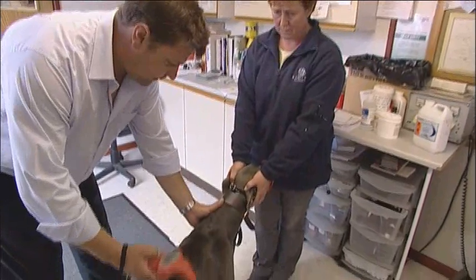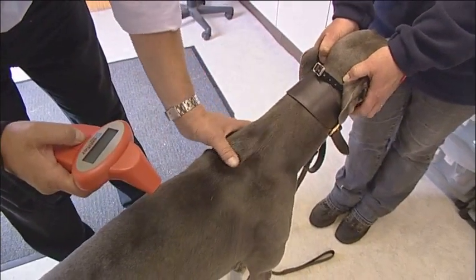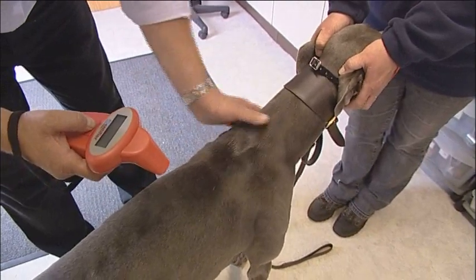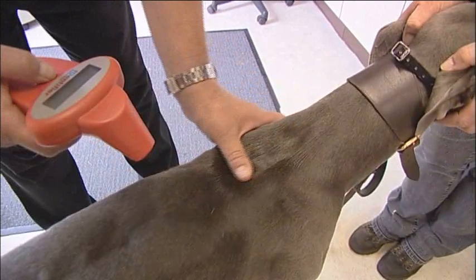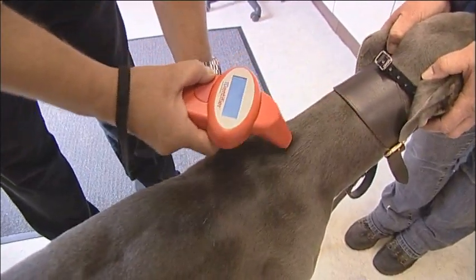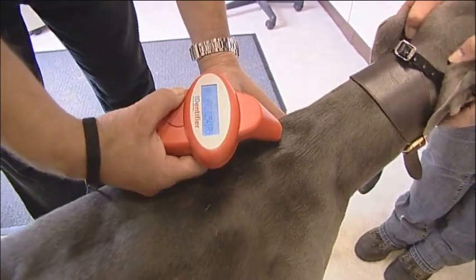To ensure that the microchip has been inserted correctly, firstly we just run our thumb over the implantation site and make sure we can't actually feel any of the chip protruding, which we can't. I then run the scanner over the site to identify that the chip has been inserted correctly.